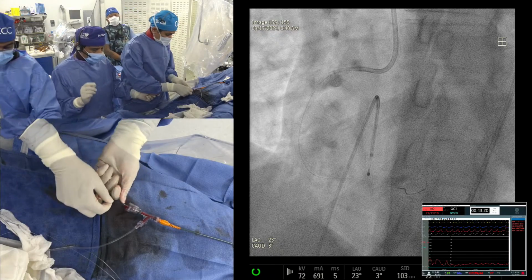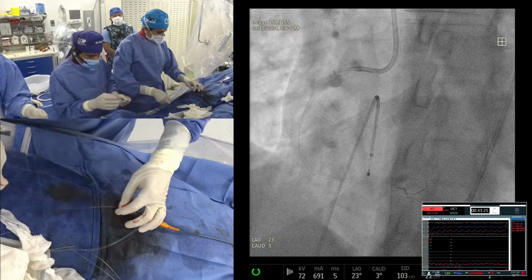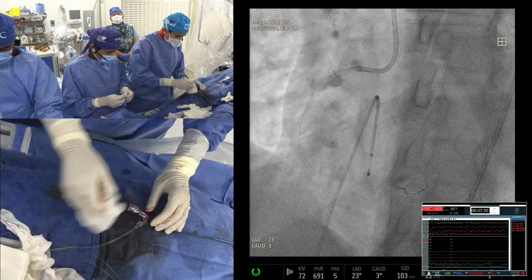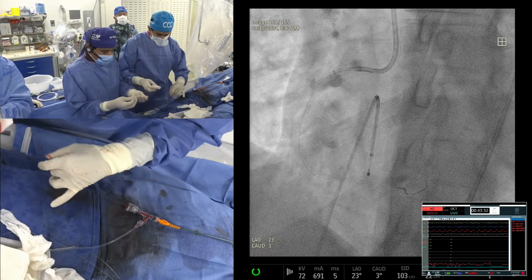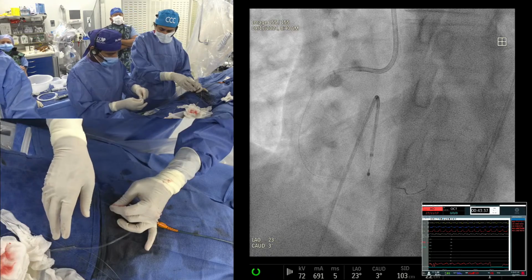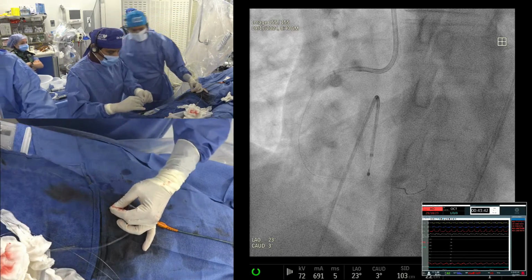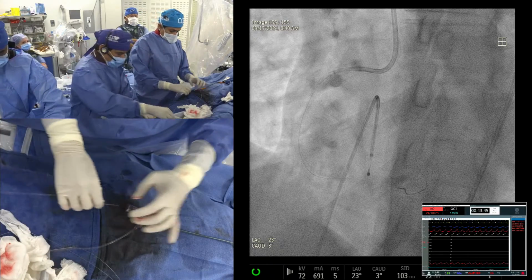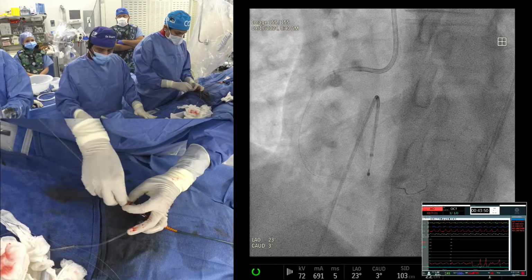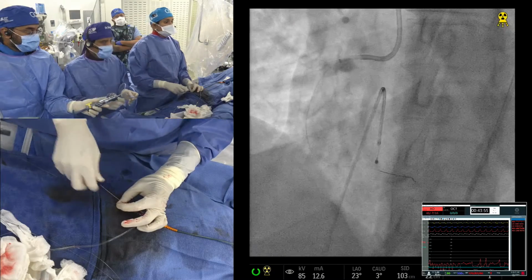So from the fracture point of view, IVL definitely does a better job. Rota will cut the plaque, particularly the internal elastic lamina. So if the question is about very thick plaque, is Rota better or IVL better? I think the only issue is that IVL may not get there, so Rota may be required. The two approaches can be used in conjunction. But to complete the answer, Rota alone can also take care of thick calcium. It will cut part of the calcium, and then a subsequent high pressure balloon or maybe a cutting balloon will do the job.